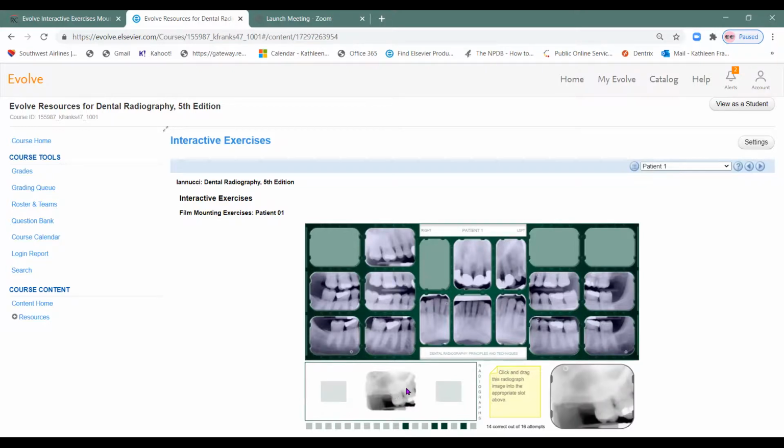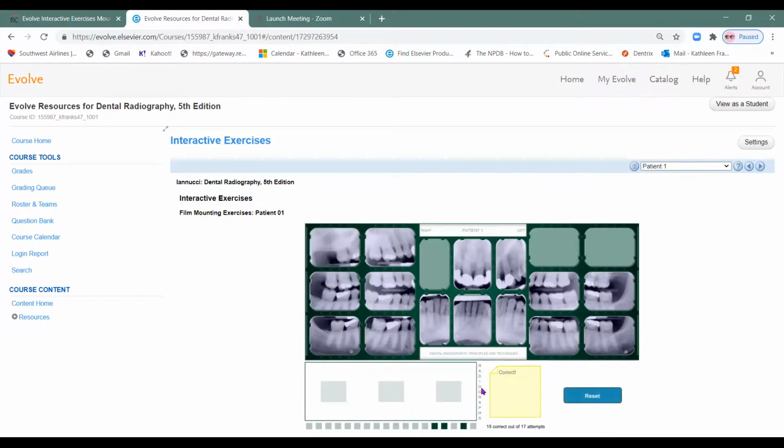molars because it has these 3 roots. We have this matching amalgam filling on tooth number 3. And we have this huge sinus. All right. Again, this is going to be an anterior because it's vertical. Okay. And there's only one that we're missing, which is this canine.